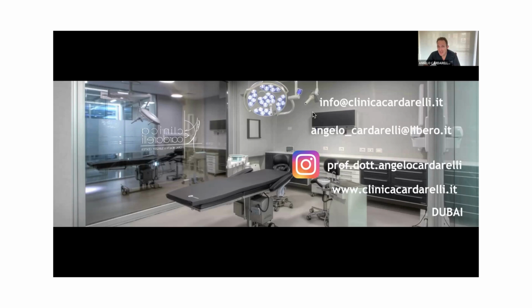Yes, you can see the height of the gums with the intraoral scan, as I told before. Exactly. So you can send the CBCT and the digital impression.